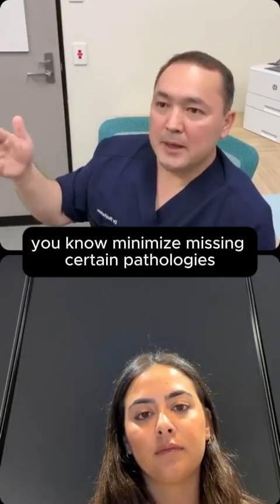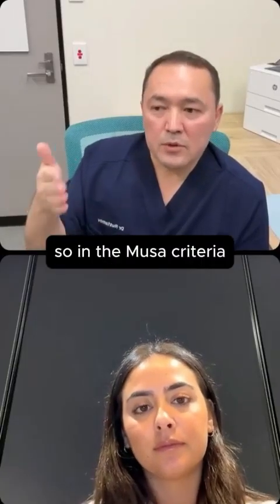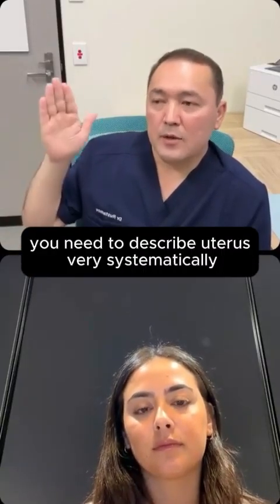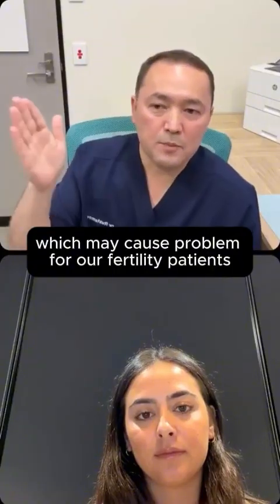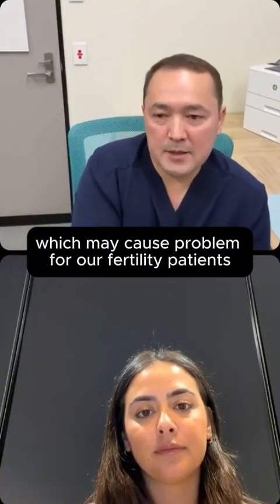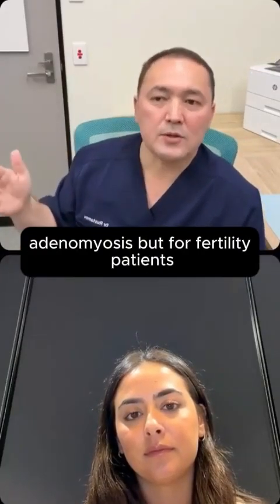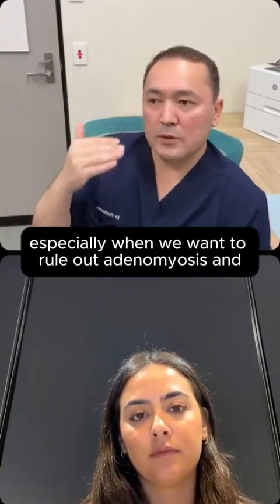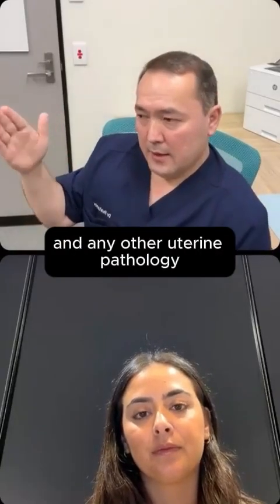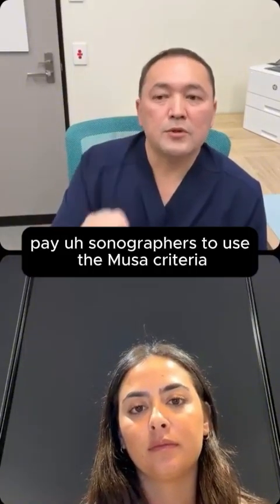So in order to minimize missing certain pathologies, we now have criteria called MUSA criteria. In the MUSA criteria, you need to describe the uterus very systematically so that we do not miss any pathologies which may cause problems for our fertility patients. The MUSA criteria are used for gynecological conditions as well, for uterine fibroids and adenomyosis, but for fertility patients, especially when we want to rule out adenomyosis and any other uterine pathology, we want sonographers to use the MUSA criteria.